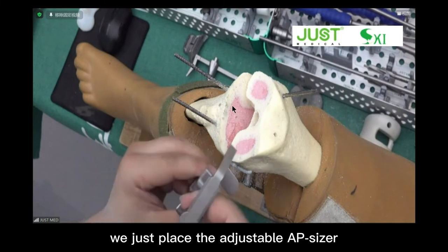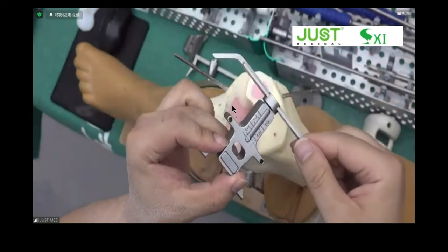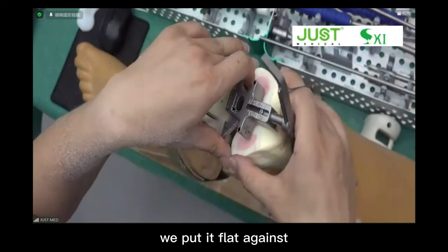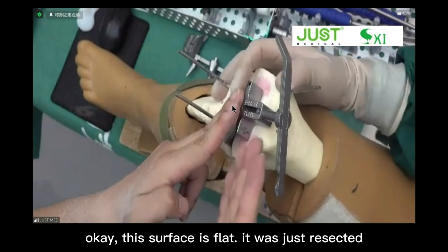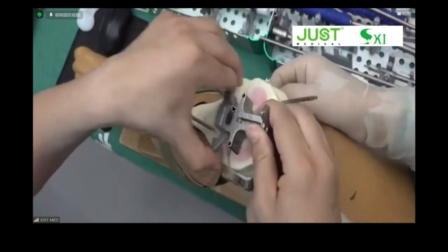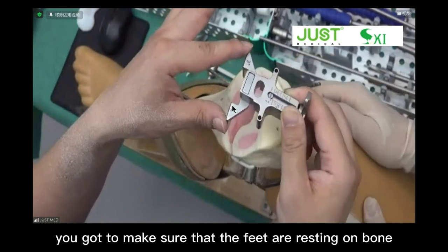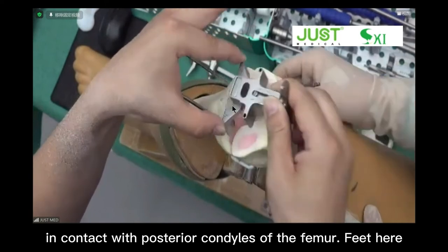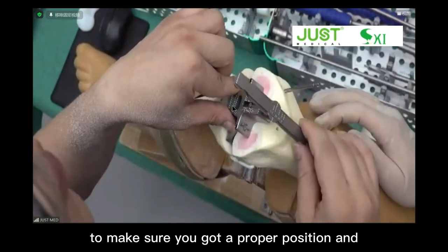We just place the adjustable AP sizer here. We put it flat against the resected distal surface. This surface is flat; we just resected it. Make it flat against it. With the feet, you have to make sure the feet are resting on bone, in contact with the posterior condyle of the femur, to make sure you have a proper position.